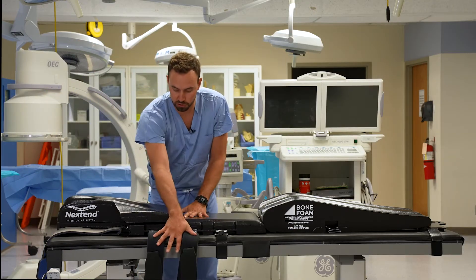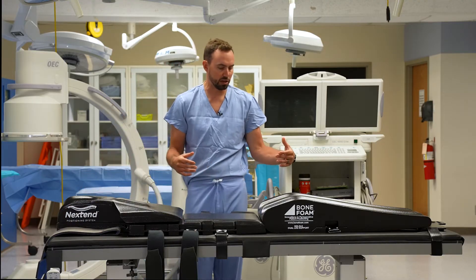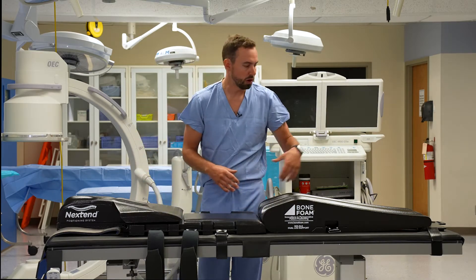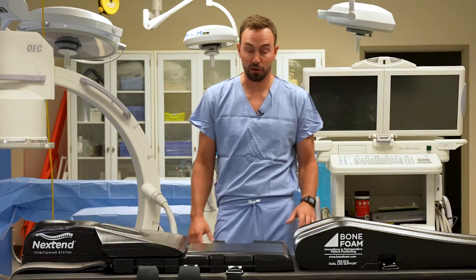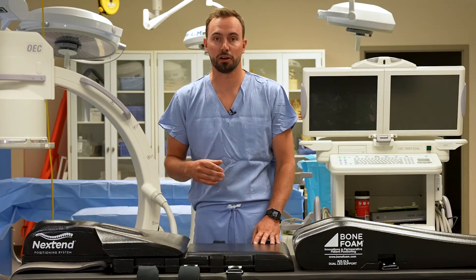Once we have our single-use components and the Y-strap attached, the next thing that will typically happen is they'll cover this with a sheet of some sort — a standard sheet tucked in along the sides. From there, the patient is ready to be transferred onto the piece. Now that our positioner is in place and we have our single-use straps connected, we can bring in our patient.